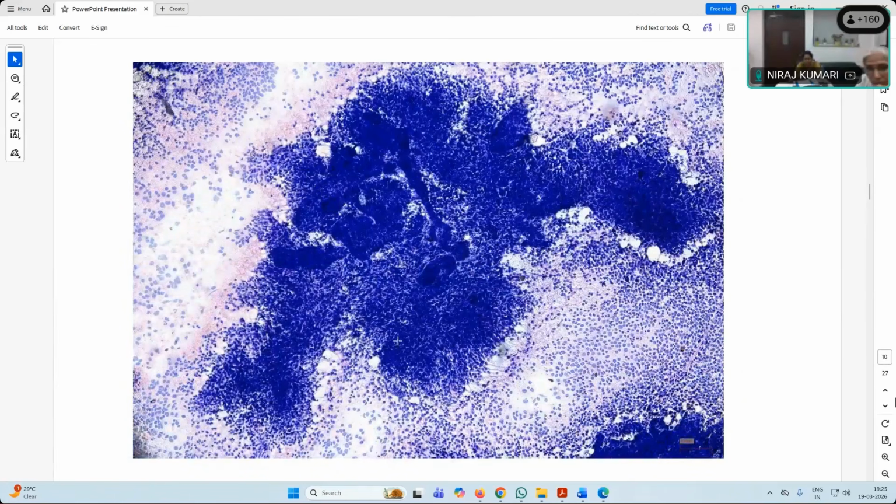It could be adrenal mass because it is the upper pole of the kidney. Location is somewhere the adrenal and the kidney. So it's a big mass obscuring the kidney. So why is this not a neuroblastoma? Ma'am, two populations of cells are seen, ma'am. The epithelial and blastemal. Okay. So you have this kind of discrete cells lying separately.